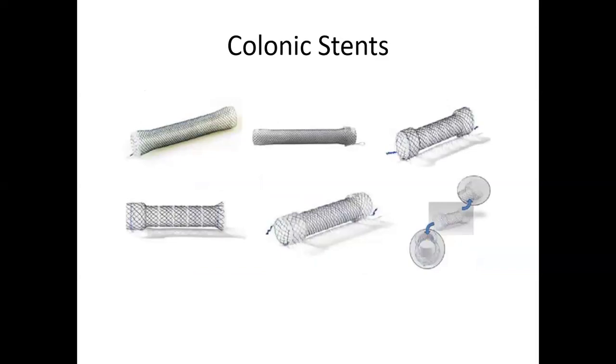If there's a partial blockage in the colon, we can still use it as a way of palliative care, or for patients who refuse to undergo surgery. As a temporary measure, we may want to push in a stent there so that contents can pass. Except that sometimes we may have complications like these stents can migrate or dislodge, so we may need to put another one. And these stents are quite expensive, so it becomes stressing on the part of the patient. But when it's done by people who are specialized in stent insertion, usually it shouldn't be a problem because we're able to suture it to the wall of the colon.